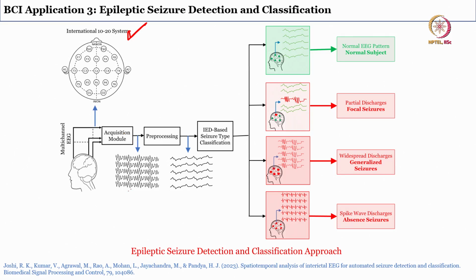So the thing is, you are acquiring the value which has this kind of transient, then you pre-process it, and it will become like this. So from this to this transition, it has removed some of the high frequency noises and retained the amount of frequency that we want. Generally for epilepsy, we keep it 1 to 30 hertz, okay, or 3 to 30 hertz. So this is just to give an overall idea that pre-processing will remove some of the non-neural part and retain the neural part.